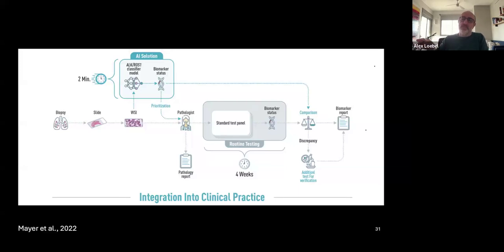With that foundation model, they build models like diagnostic models. For example, in this case, the startup that I mentioned is called Imagen. They have their data set that they paid for. They developed this model for predicting actionable biomarkers for lung cancer. So they have a model specifically for actionable biomarkers, and they provide it as a service.